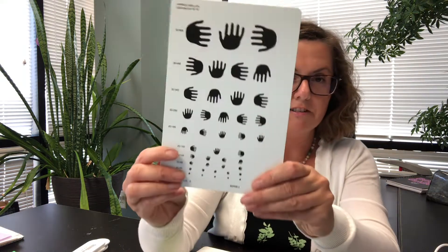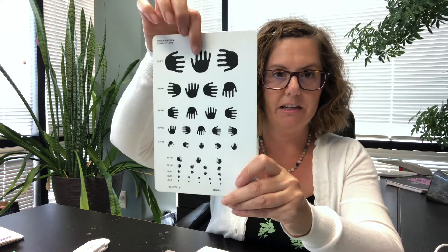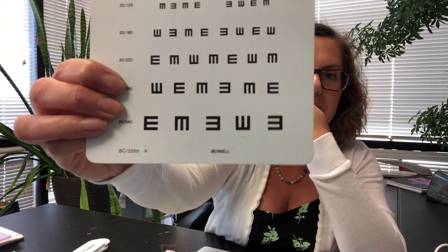Moving away from infants into more of a toddler phase, I'm going to show you some of the things we might use to assess toddlers. This one is orientation of hands — they would have to show you which way the hand is pointed, up or off to the side. This one is called tumbling E's, and similarly they would have to tell you which direction the E is pointing — up, down, or to the side.